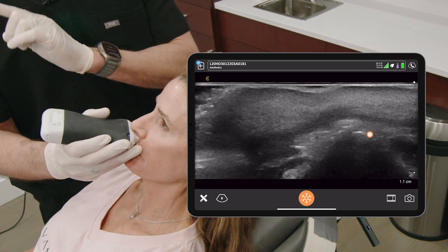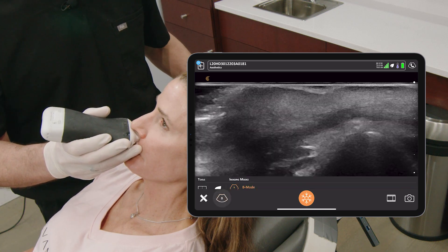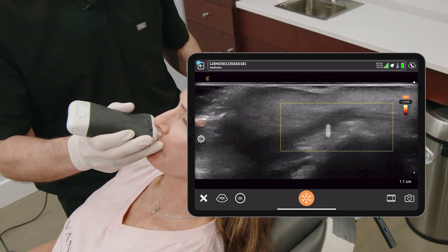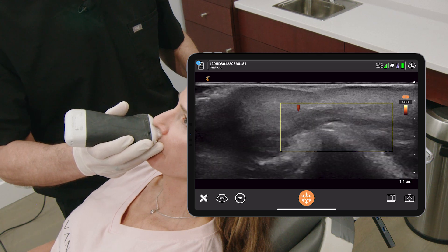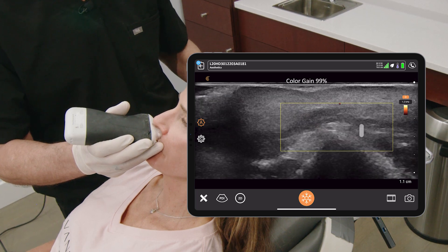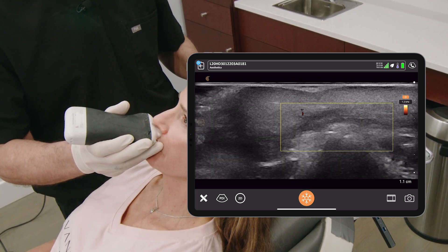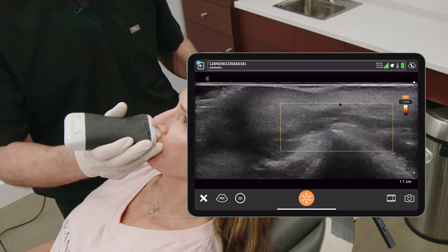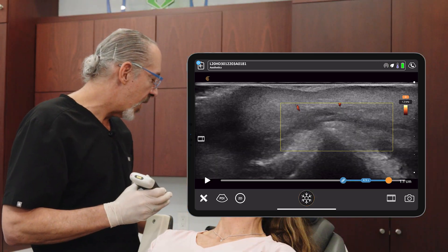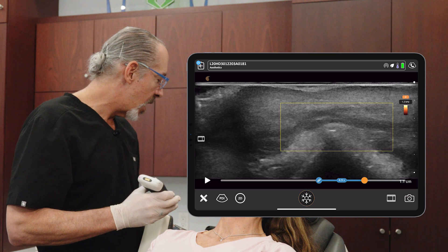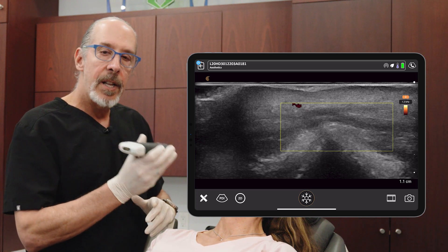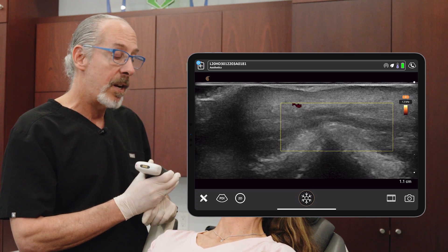Sometimes there's a midline artery along the nasal spine. Let's take a peek in this patient and see. You do see that there is a vessel here, but it's not on the bone where you're injecting in the nasal spine area. So this patient checks out — a deep injection on the nasal spine is okay to give support to the nose.